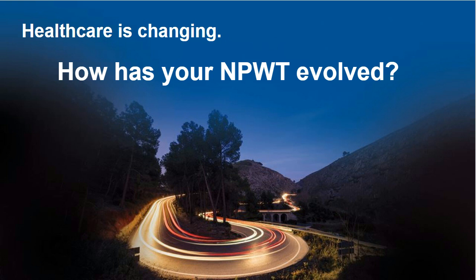Yeah, the physics background of my engineering world makes me smile when I see these kind of questions, and I appreciate them. And at the end of the day, as we went into presentation, when you have a vacuum system, the material and the matter in the system will always move from an area of high relative pressure to an area of low relative pressure. And it's actually that relative difference between two sides of the system which creates the speed or the power with which you can remove or move any fluid. So having that gradient is critical in order to be able to effectively remove fluid or material from a wound to a canister. And the better that gradient, the more quickly that fluid will move.